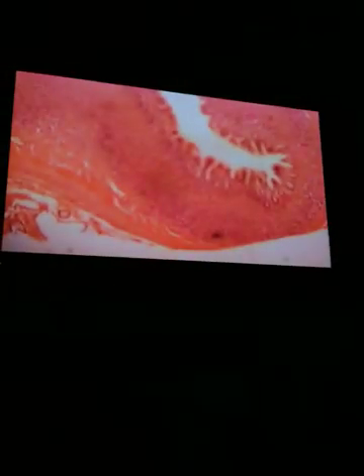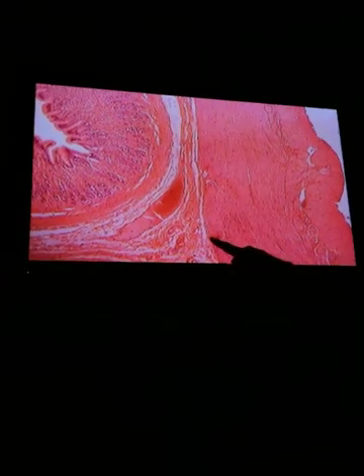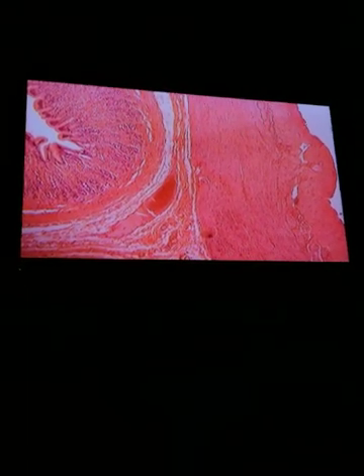Now let's back off and get a far away view here. They can sometimes also ask about the different muscular layers. So you have 1, 2, and the inner one 3: oblique, circular, and longitudinal. Let's see if we get a better view over here. No, not really. That's about as best you're going to get.